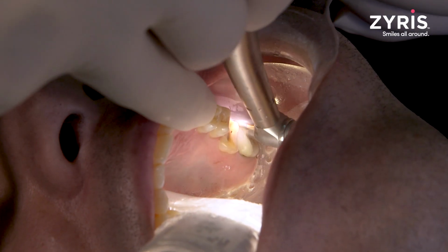He had some re-decay on the distal of tooth number 14 because there was a diastema space between 14 and 15. So what we plan to do today is to go ahead and do a full crown restoration on 14 and a full crown restoration on 15.